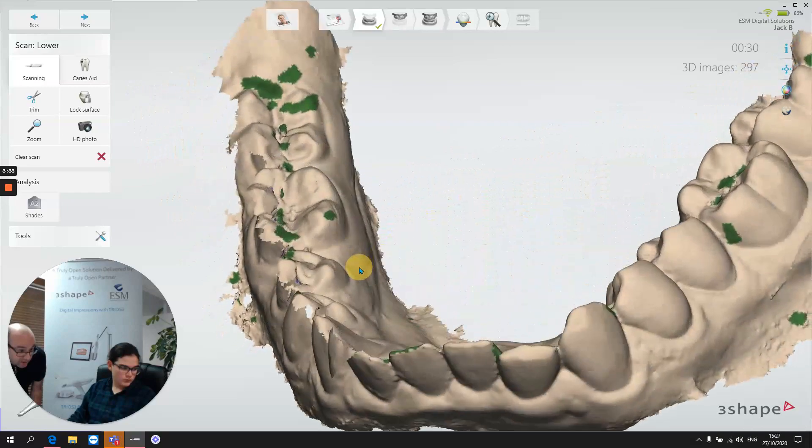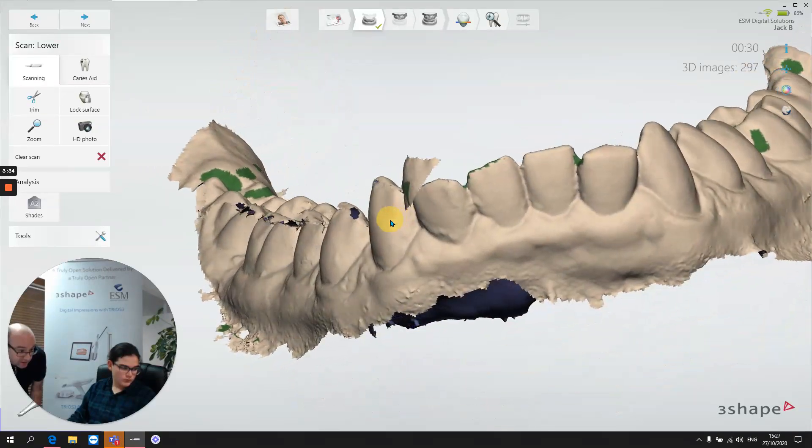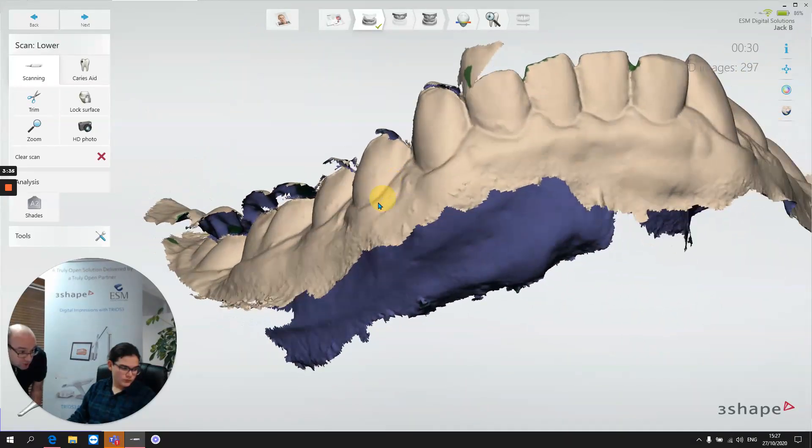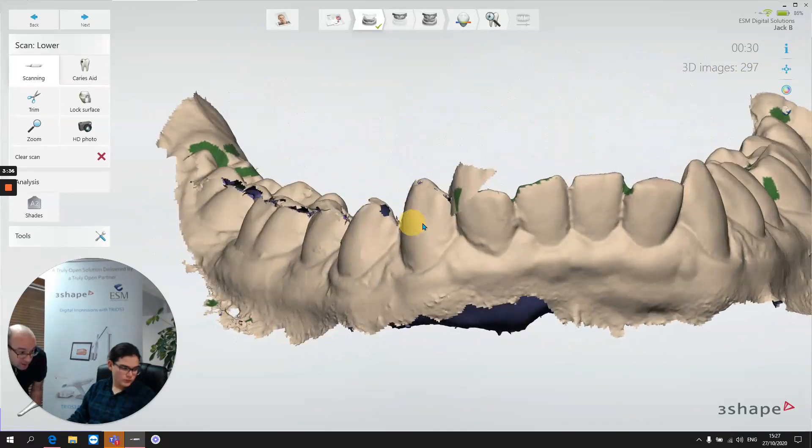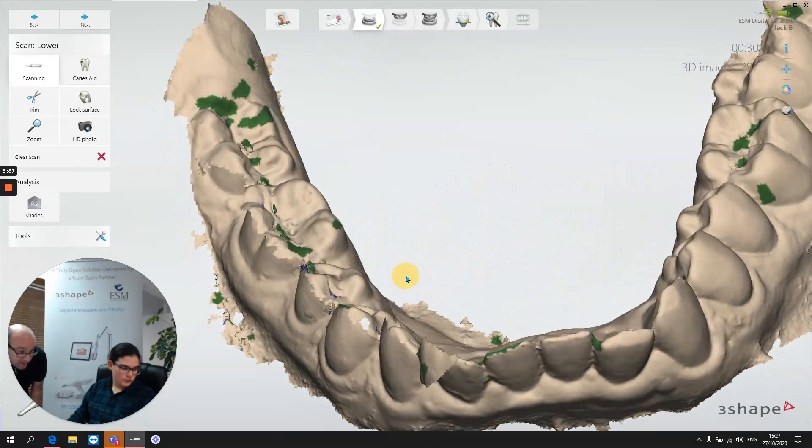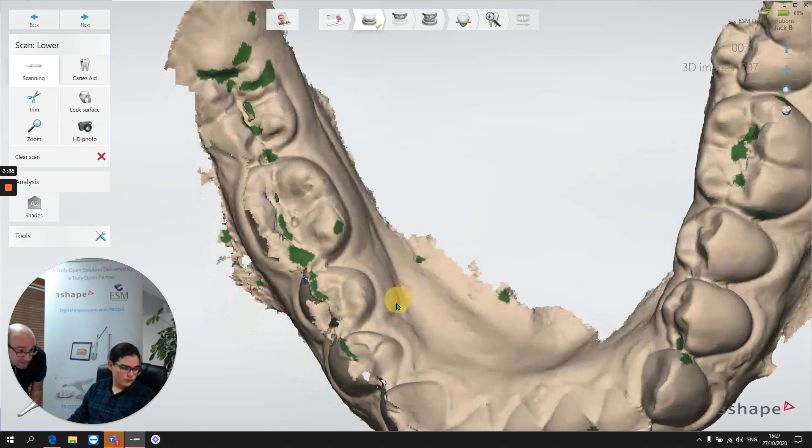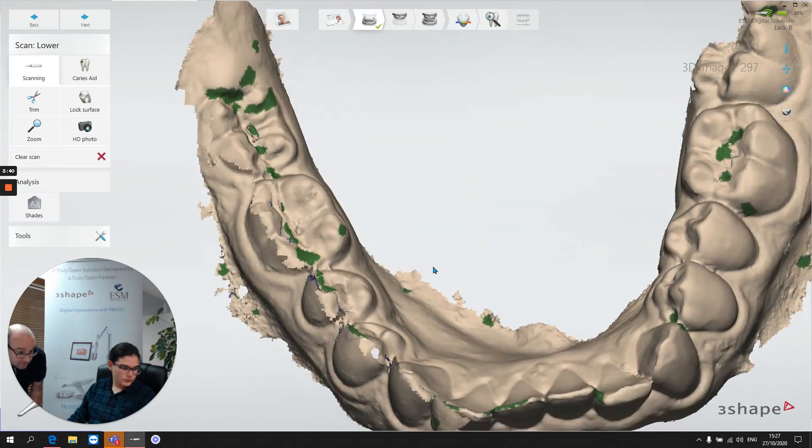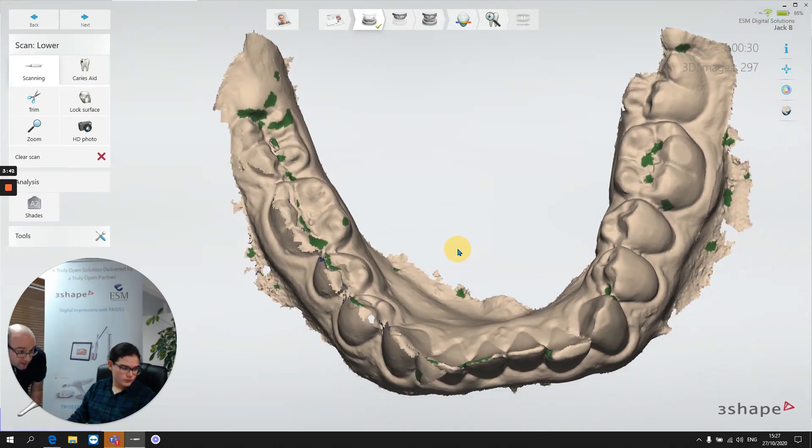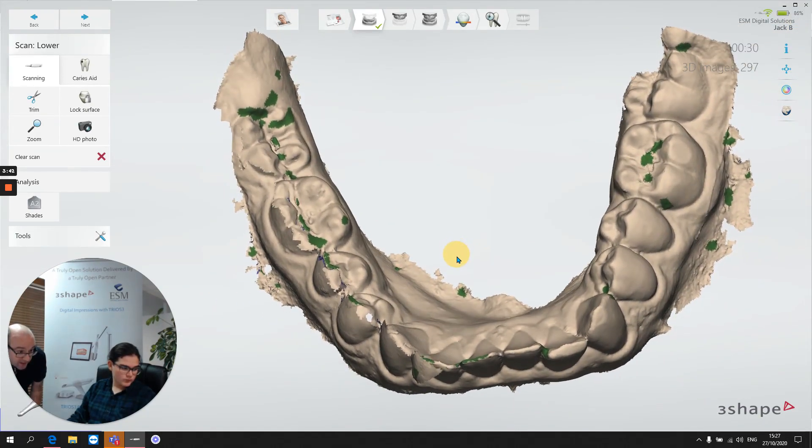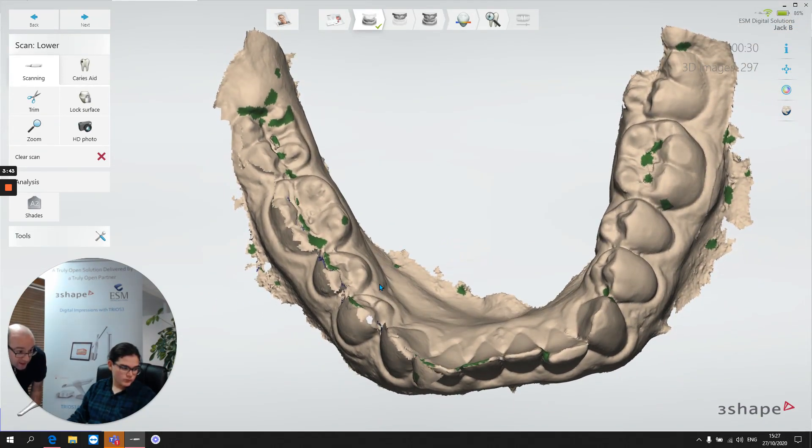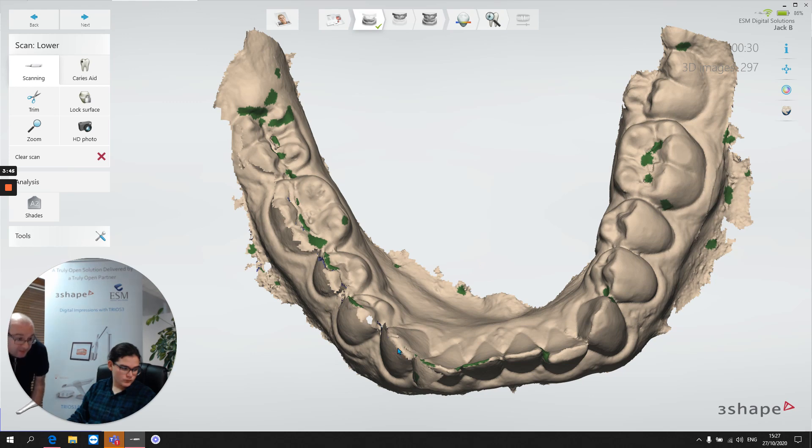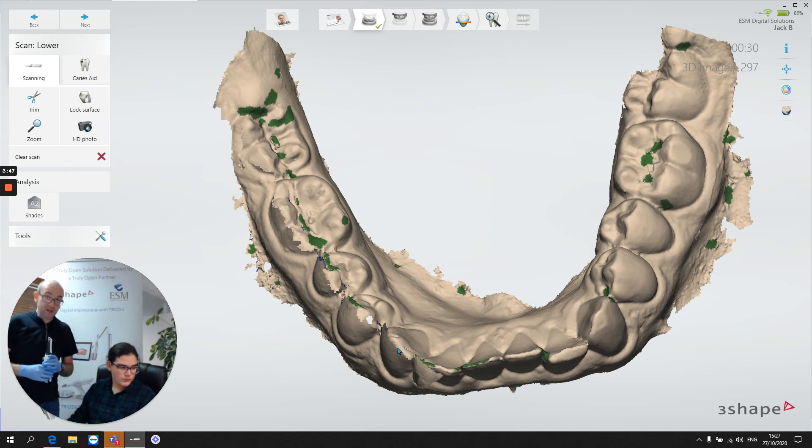And in fact, there we go, look at that. So you can see there's a huge discrepancy between the buccal scan and the original occlusal scan. And the reason for that is because the software didn't have any occlusal detail to stitch onto.